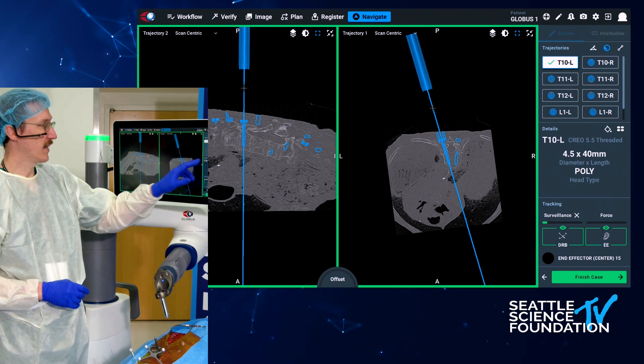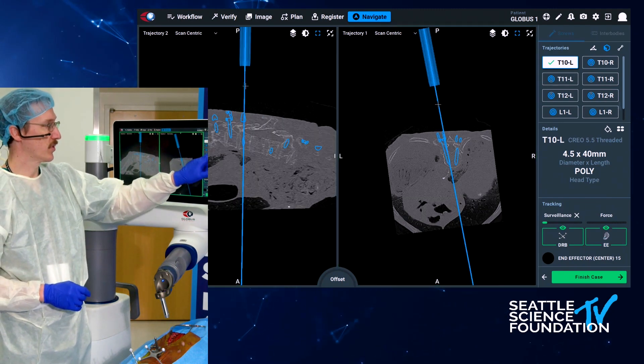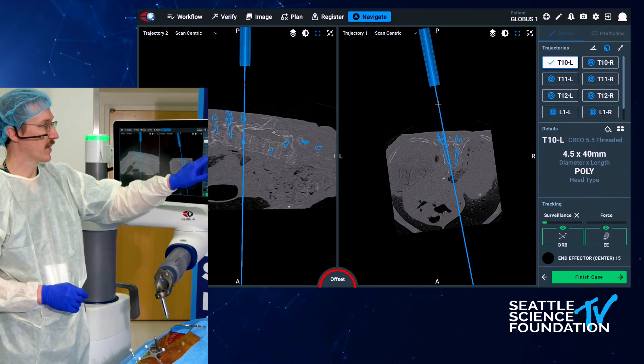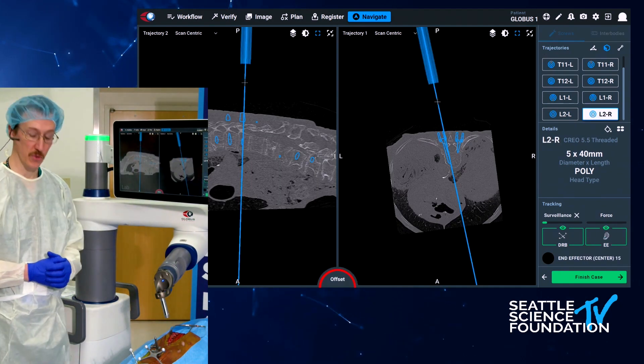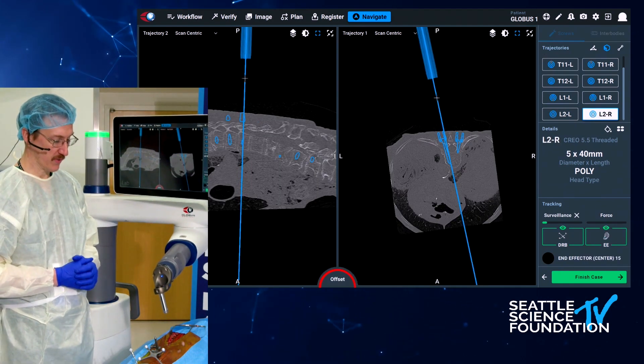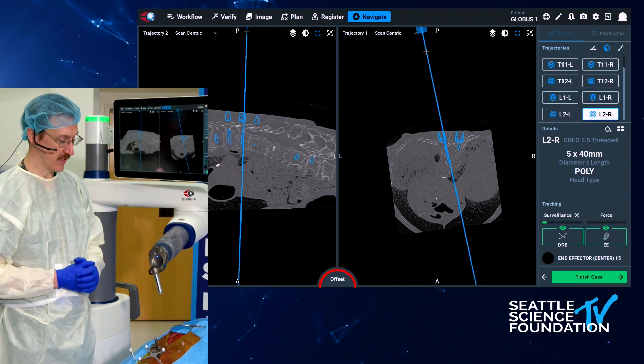Now I will do a percutaneous screw. I'm going to switch down to our right L2, just so it's a little bit further away, so the tower doesn't interfere with our visualization of the other technique I'd like to show you.